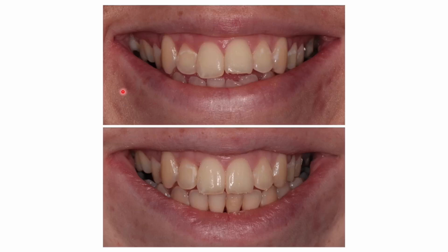That's us at the end of alignment, and actually we achieved a bit more than we thought we were going to get here. We got class 1 on our incisor relations, and we did actually get an overlap there, so it was a positive overbite in the end, which we were pleasantly surprised by. I'm just going to make an observation about it. We've improved the alignment, but the smile itself is still probably just not quite singing at us. So it's okay, but it's not brilliant.